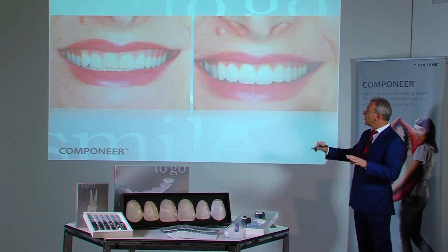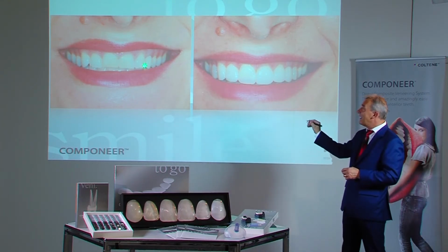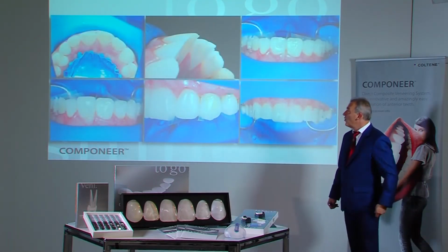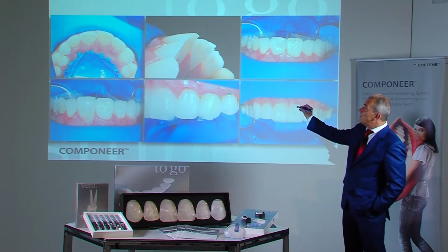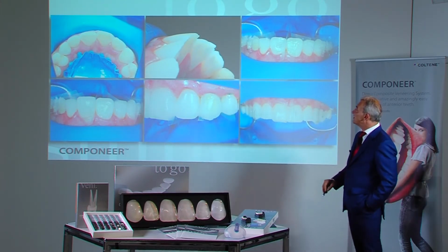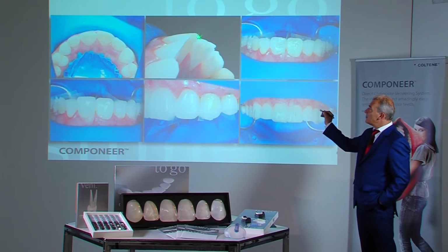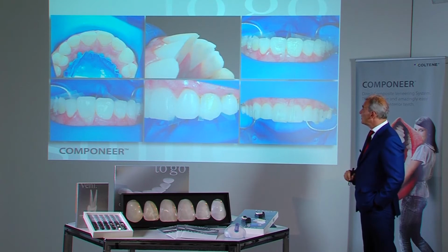Diagnosis was implemented, and it was decided we could move the anterior teeth slightly to the front. As they are already fairly inclined, this gives us the opportunity of building up sufficient material to restore the anterior teeth in a sustainable manner. Actually, there's no need to prepare the teeth, as we have palatal loss of substance and some erosion. From that point of view, we're dealing with a combined case of erosion plus abrasion. As we want to shift the anterior teeth slightly to the front, palatal preparation is not necessary, as the substance has already been abraded.